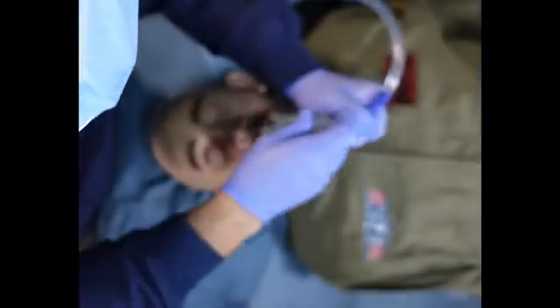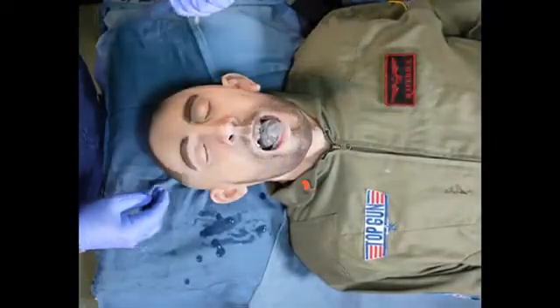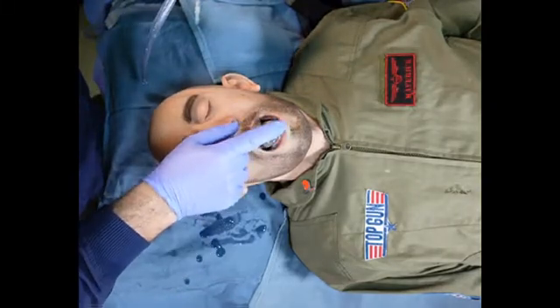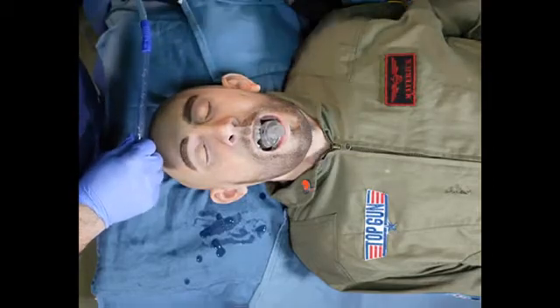Push the tongue into the floor of the mouth, lift the tongue off the posterior pharyngeal wall, place the supraglottic airway under the epiglottis. And before I ventilate, I'm going to want to suction the supraglottic. Two ways to do that, of course. The first way is with a flexible suction catheter.